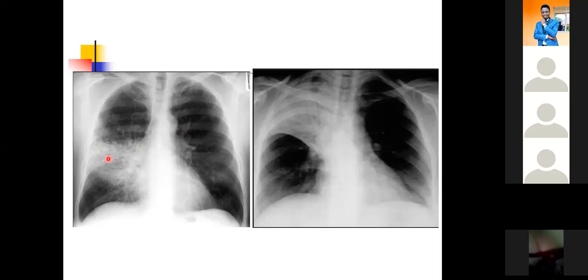So there is an area which is looking white within the lung parenchyma right there. And the second thing, let's look here. We cannot trace the boundary between the lung and the right heart border. That boundary is indistinct or it is lost. So what I'm trying to explain here is that that loss of boundary is what we are referring to as the silhouette sign.